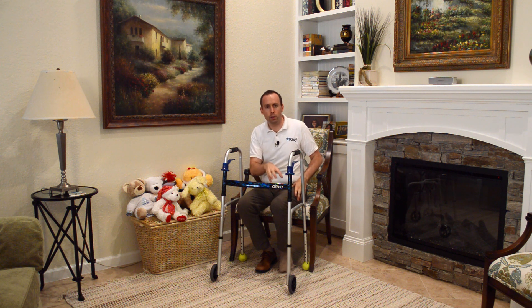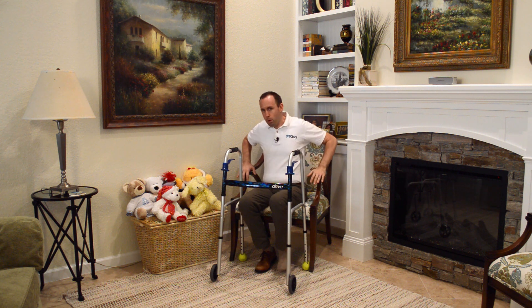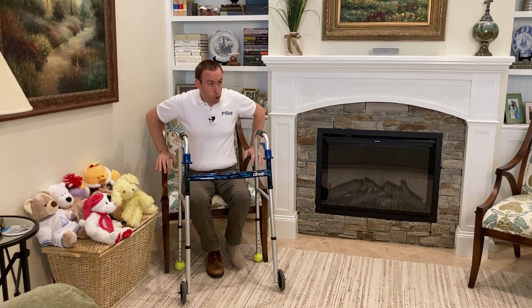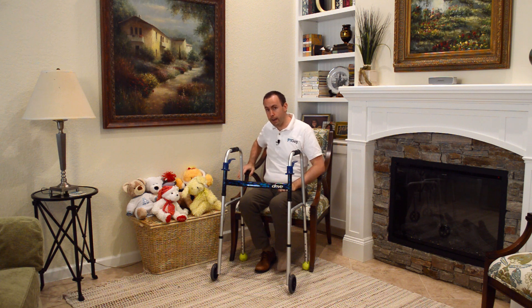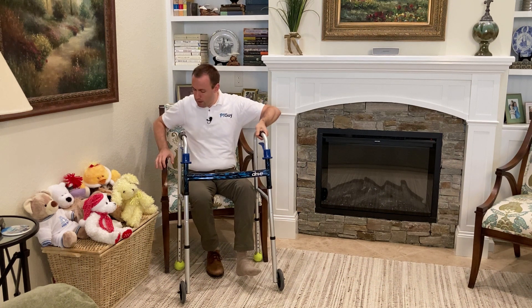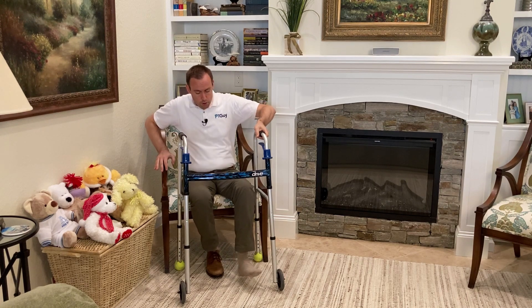So instead, we're going to use the walker to almost create that leg again. The hand on your weaker side — the leg you're not allowed to put as much weight on, or maybe don't even have — that hand should go up on the walker first. Going from both hands on the chair to both hands on the walker means going from two points of contact, to zero, to two. That zero is very scary and very risky. So keep one hand down on the chair and put one hand up on the walker.